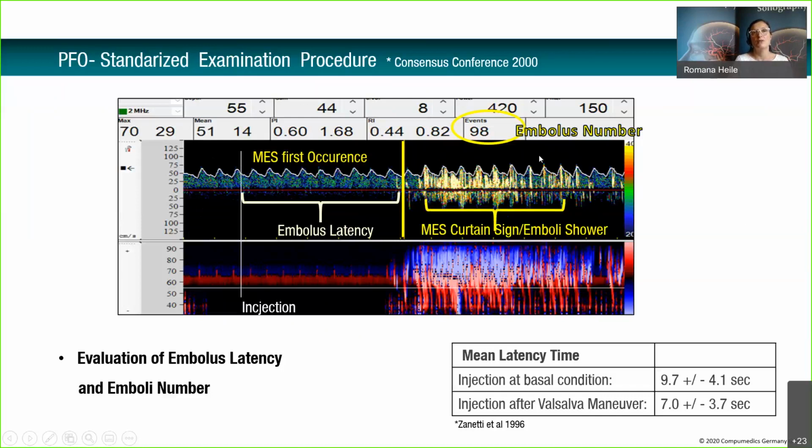So the time that bubbles will be counted is shorter than in the second option. This is the doctor's opinion, whether they go with this literature or that literature. It's completely up to the local department and the local TCD school, in which direction they are going.